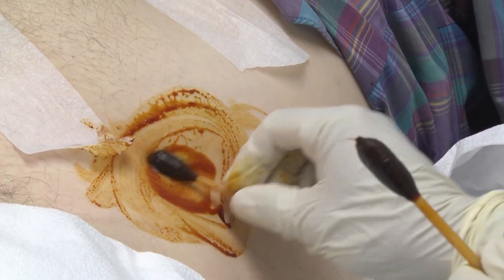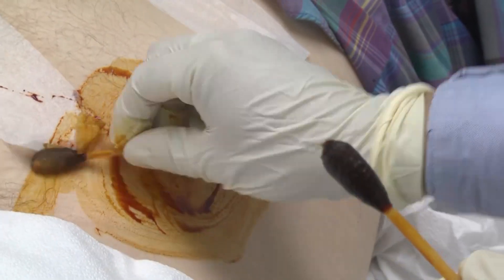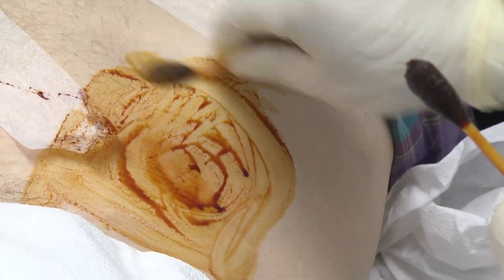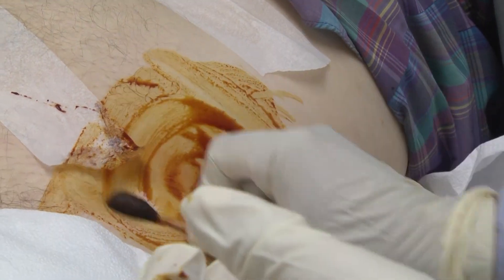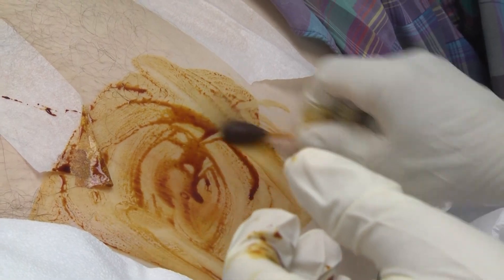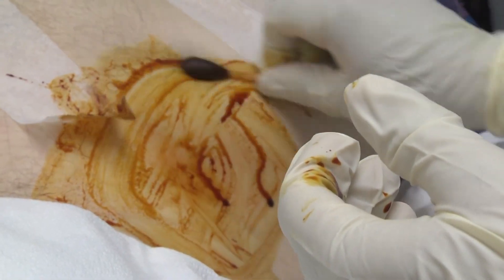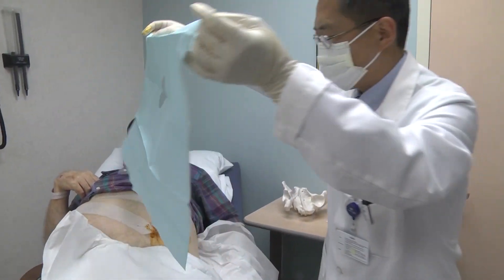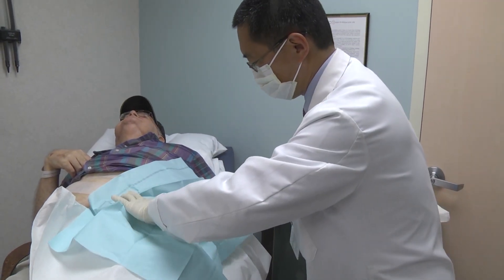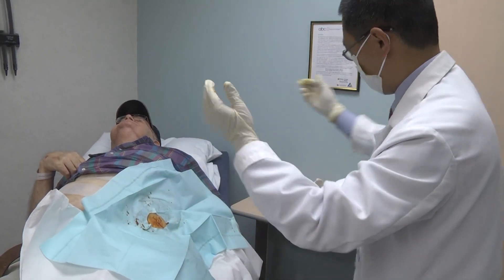From the second step on, the same routine. We are using a sterile drape — you can see it's a little different — with a penetrated cover to cover the area and expose the point.